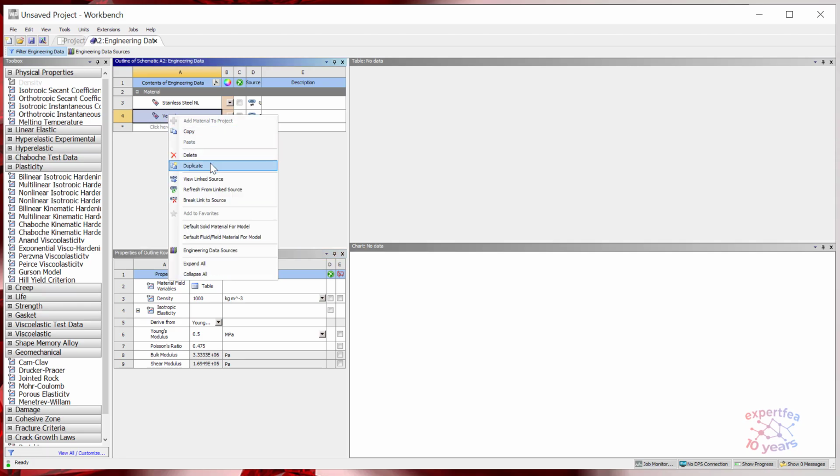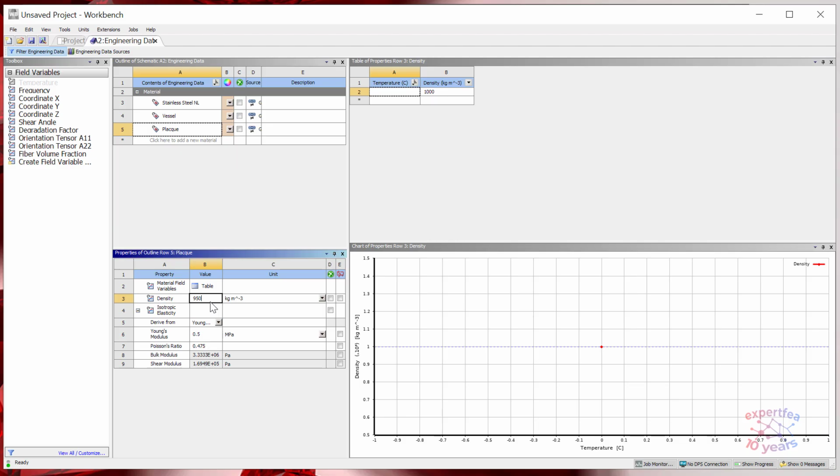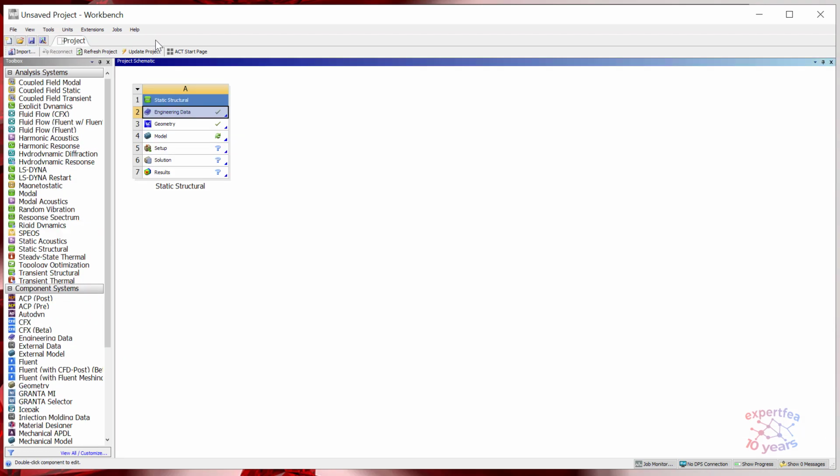Let's duplicate this and create the Plaque material. Density, let's make it a little less. Let's make it even softer, and we leave this the same. Alright, so we have the materials defined, and we go back to the main window.